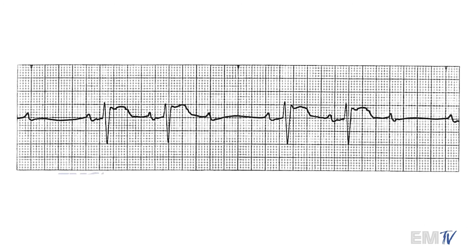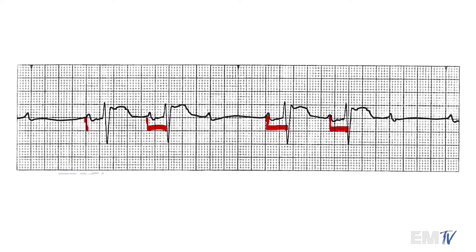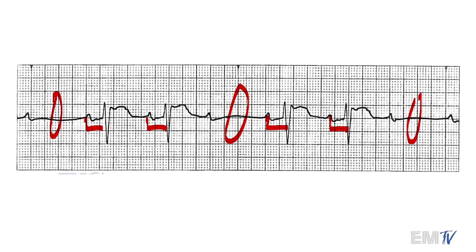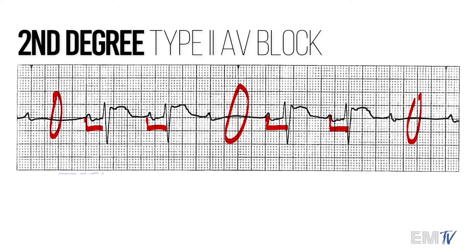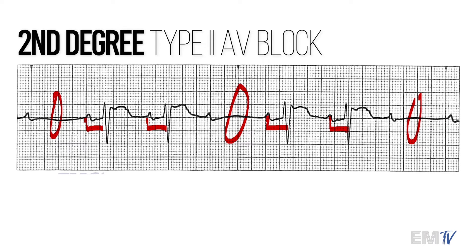As there are two different kinds of second-degree heart blocks, we'll need to look at the PR intervals. These PR intervals — the ones that are connected — the duration does not change. Because you have a fixed PR interval here and a complete drop-off of a QRS complex, my diagnosis of this rhythm would be second-degree type 2, otherwise known as Mobitz II. And again, this is a form of heart block.